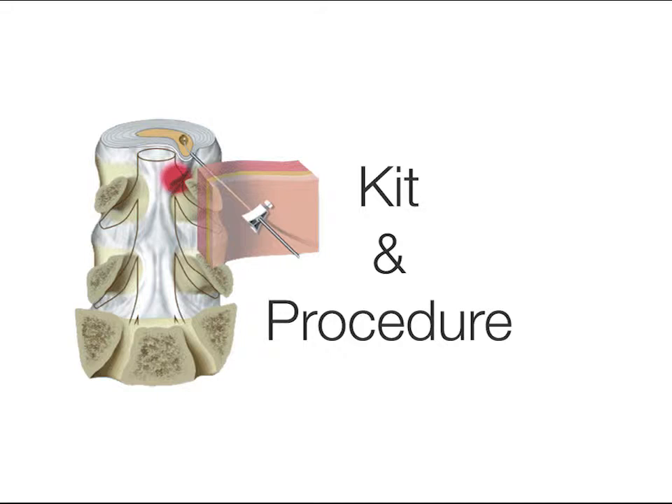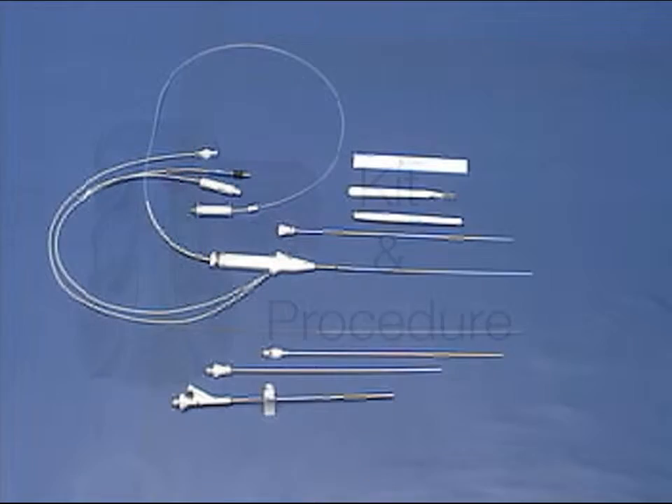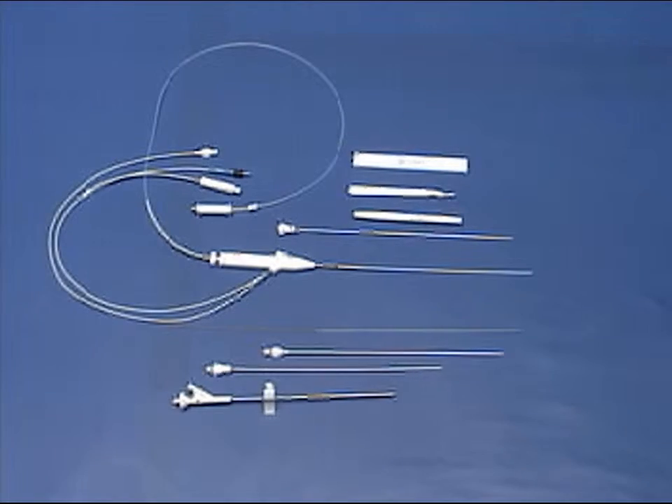In this video, we will introduce the LASE kit components and show you how to set up for and complete a LASE procedure. First, let's identify all the items in the LASE kit.